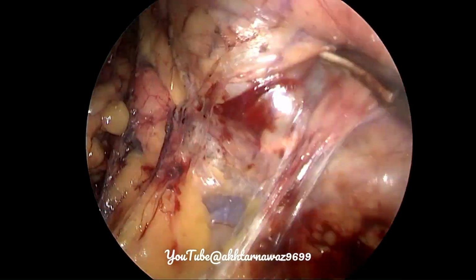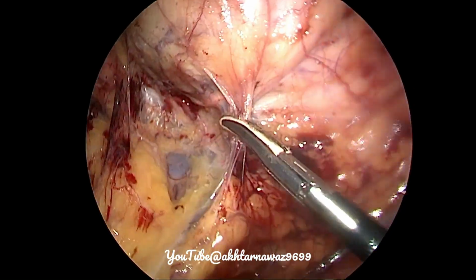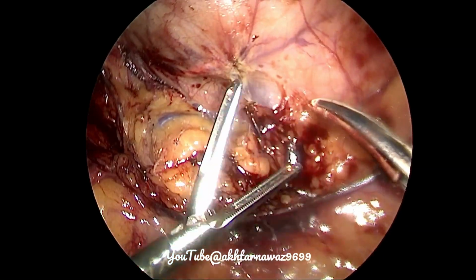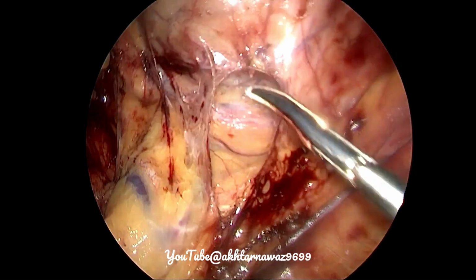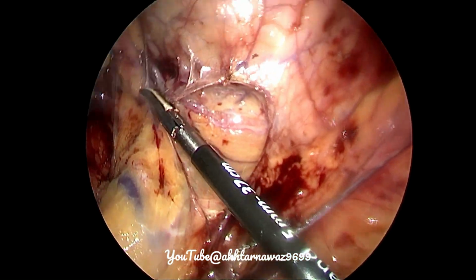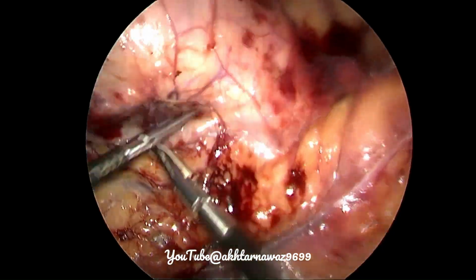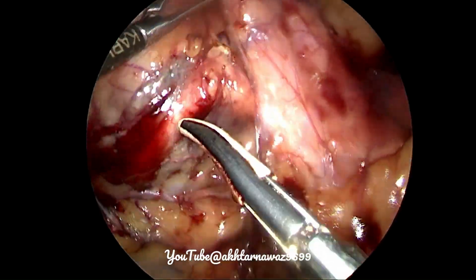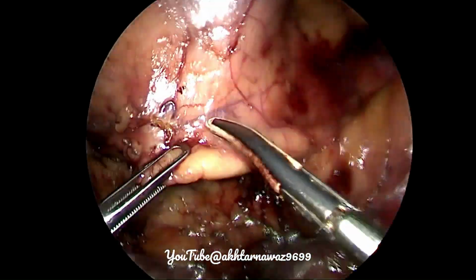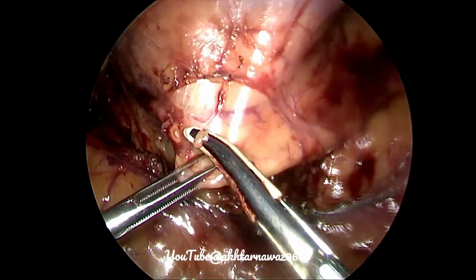This lady, around 53 years of age, presented with left flank pain, showed a parapelvic cyst, and on a DTPA scan showed moderate obstruction. So we decided to go for the intervention. Here you can see that we are trying to identify the ureter. This is the gonadal vein here, and we can feel the DJS stent inside the ureter. So this is the ureter having a DJS stent.